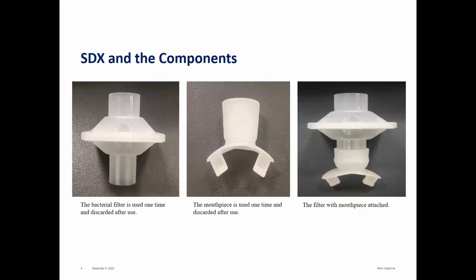This slide also shows the SDX and its components. The first picture shows what the bacterial filter looks like. It creates a protective barrier between the patient and the breathing tube, also known as the honeycomb, to help avoid any contaminants to the other parts, such as virus and bacteria. The bacterial filter is used one time and discarded after use.